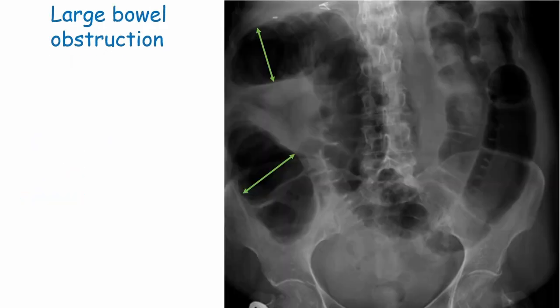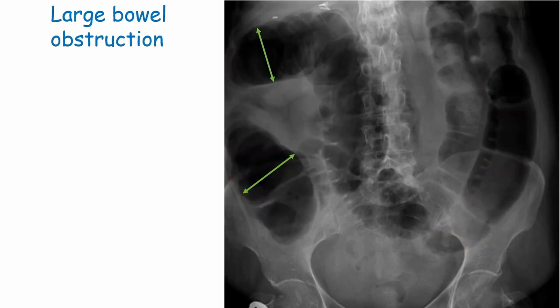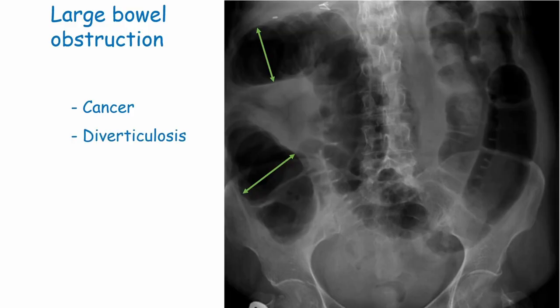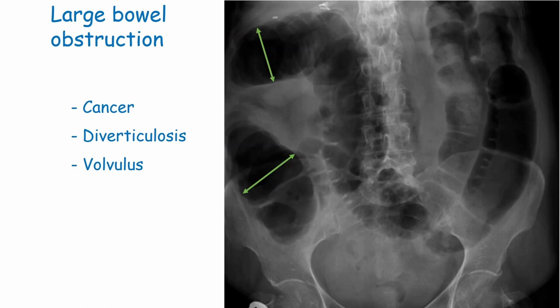Large bowel obstruction shows the ascending and descending colon on the periphery with haustra visible, and the bowel measuring over 6cm. Causes include cancer - either in the bowel itself or from another organ compressing it. Diverticulosis, outpouchings of the bowel mucosa usually linked to a low-fibre diet, is another cause. A volvulus occurs when part of the bowel twists on itself and its surrounding mesentery, similar to twisting a long balloon; in adults this generally occurs in the sigmoid colon or cecum. Hernias can also cause large bowel obstruction.